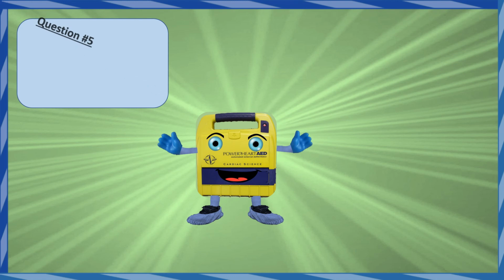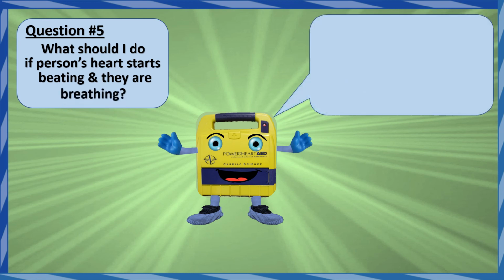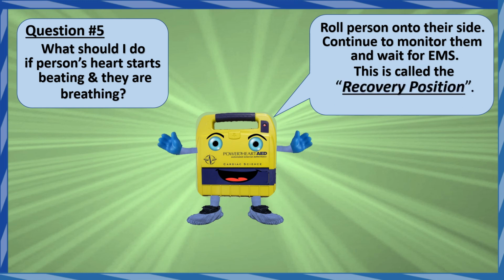Question number 5. What should I do if person's heart starts beating and they are breathing? Roll person onto their side, continue to monitor them, and wait for EMS. This is called the recovery position. Here is a picture.